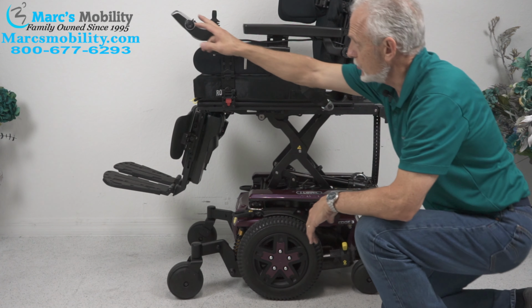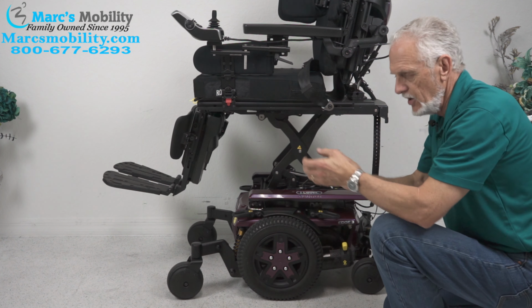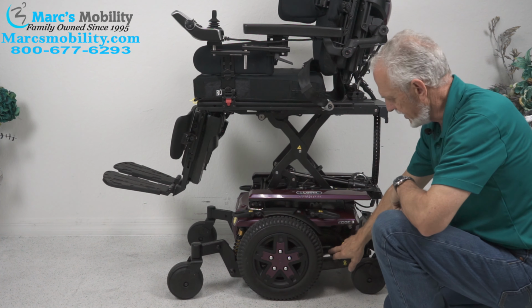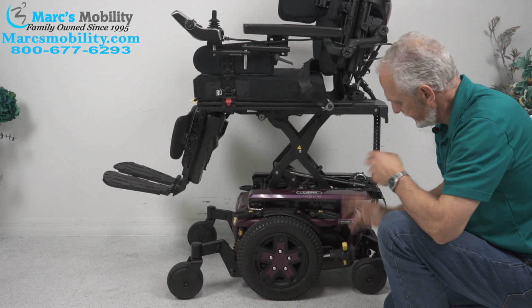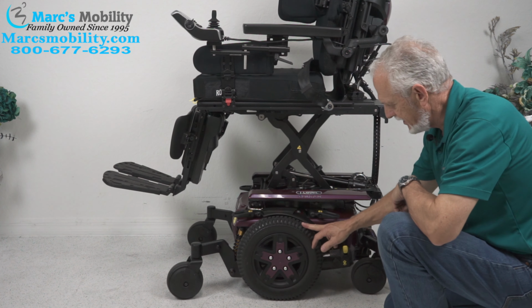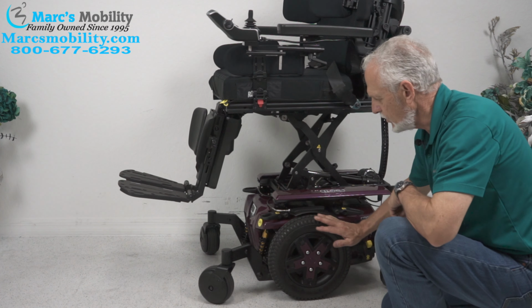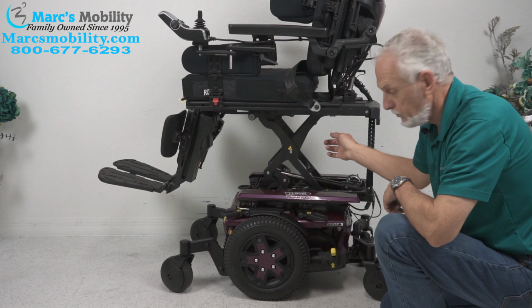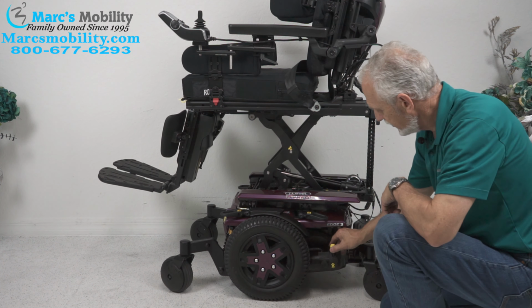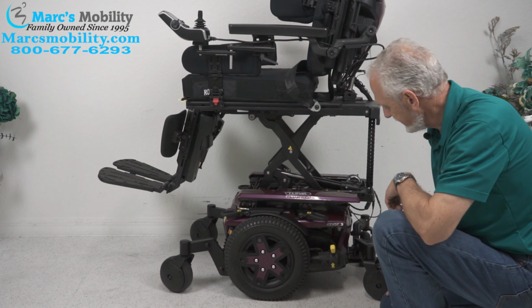To put it in neutral, you would turn the power off first. The reason you want the power off is you want no resistance in the motor right here. Once the power is off, there's your neutral lever right here, push it down. What that does is it unlocks your wheel right there, okay? So you can see the wheel is unlocked. Do both sides, then you can roll it around. When you put it back in gear, you can see we're back in gear, okay?